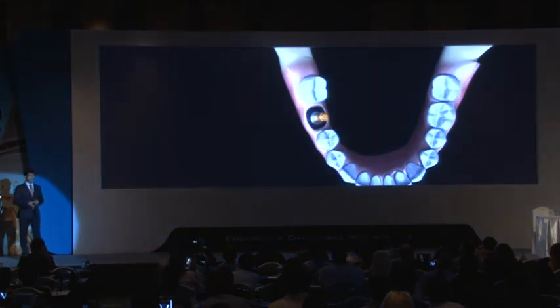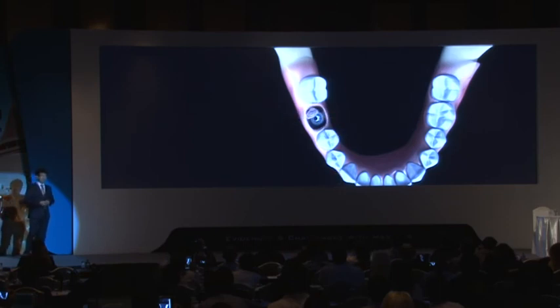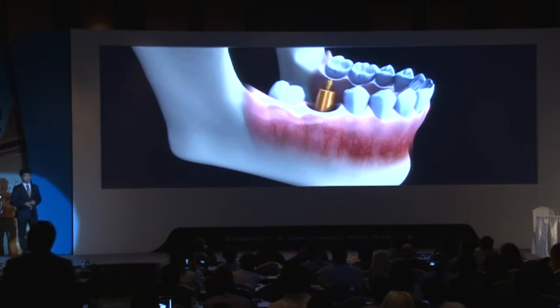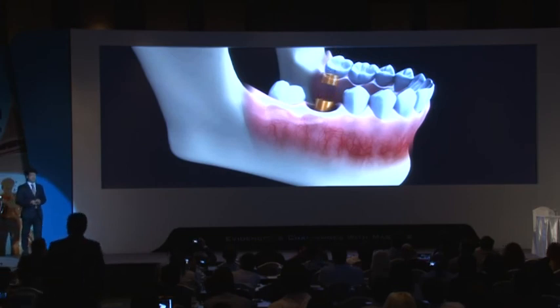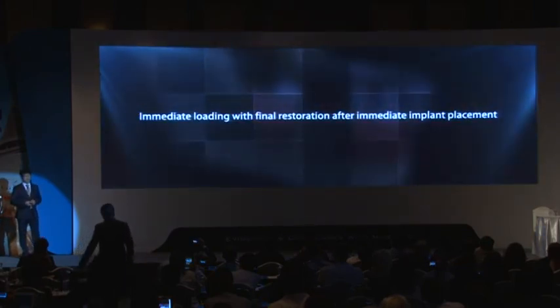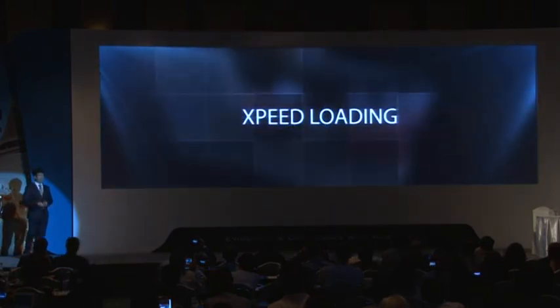Then, the gap between the implant and the extraction socket was filled mostly with autogenous bone. And the final prosthesis can be delivered 1 week postoperatively. So this is not just immediate loading. I decided to call this loading protocol X-speed loading.